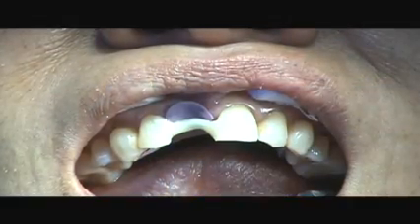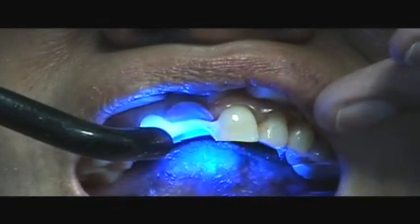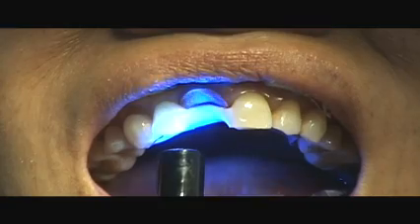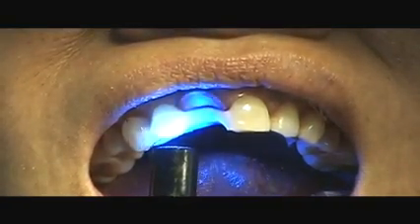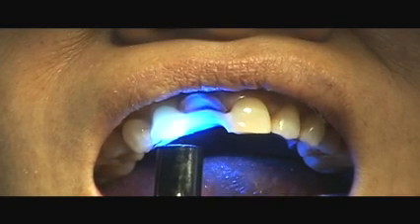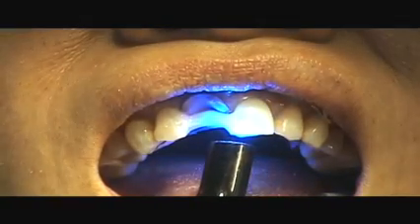The material is fully cured and inspected. The stent is bound into position with the hardened composite. Here one can begin to vary shades to ensure aesthetics.